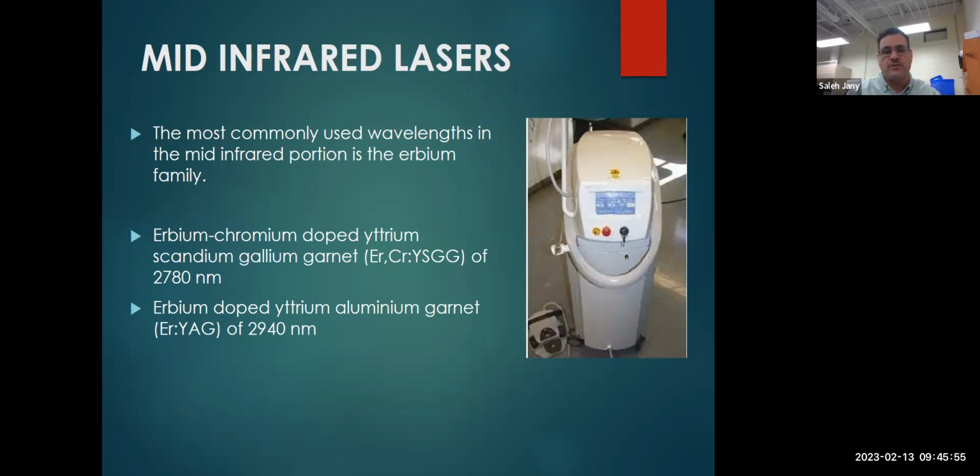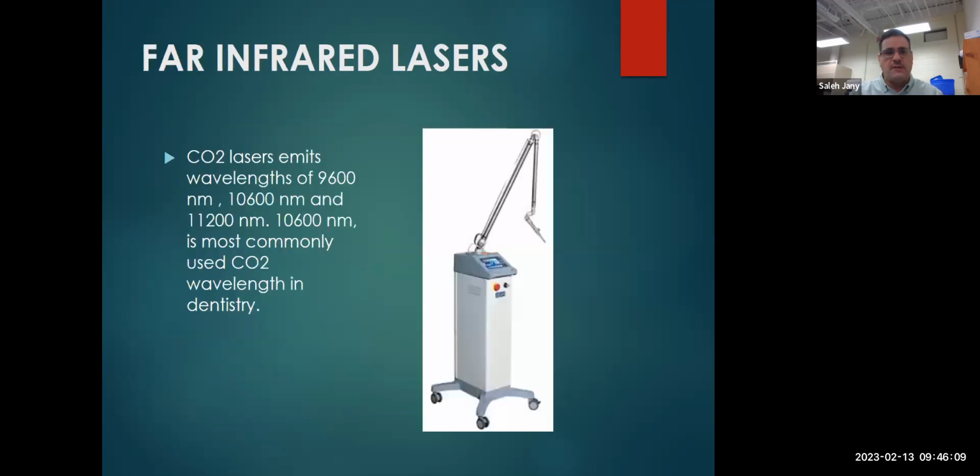When it reaches healthy tooth structure, the fluorescence will stop and it will stop damaging the normal tissue. That's the thing. It has a diagnostic effect. That's why it's very expensive, but they use it for gum disease and for cleaning of teeth.